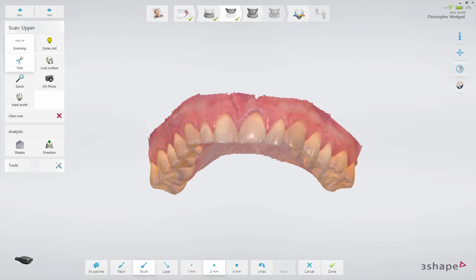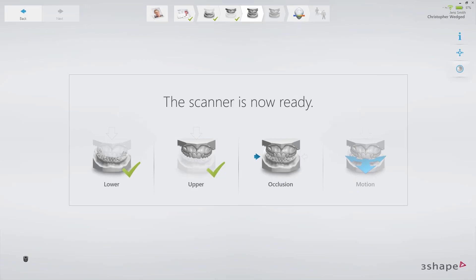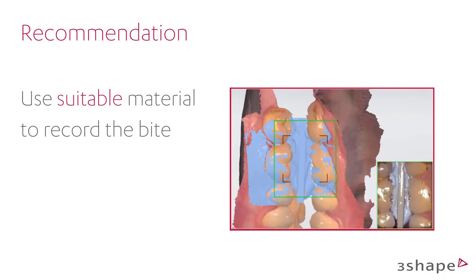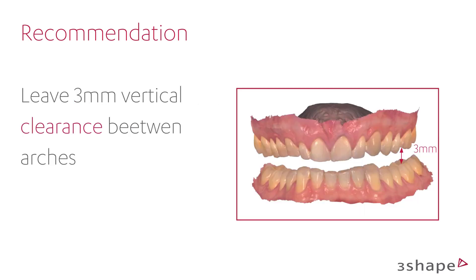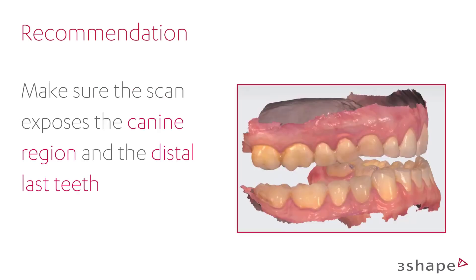Before you move on to the bite scan step, prepare your preferred bite method and follow the recommendations to set it correctly. Ensure a stable jaw position with a gauge or gig in the therapeutic bite position. Leave 3mm jaw space between the arches and at least 5mm clearance between the two opposing anteriors. Make sure the scan exposes the canine region and the distal last teeth.